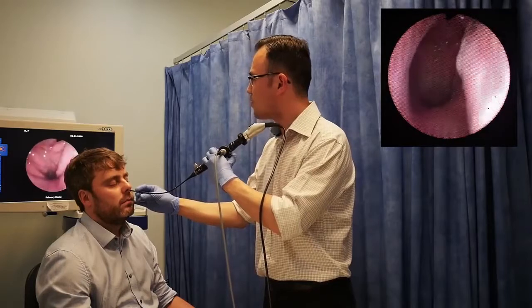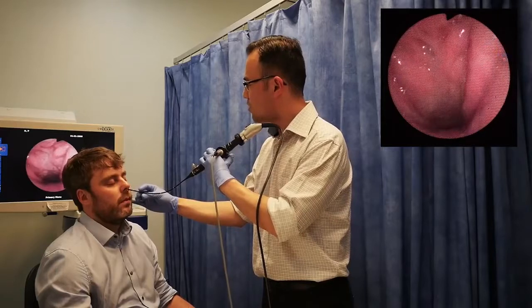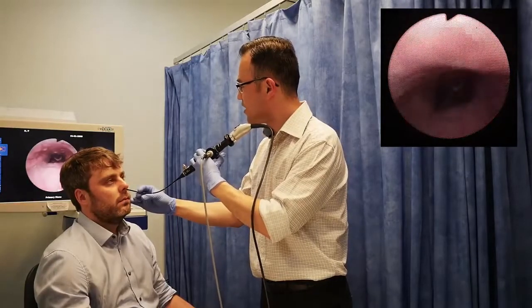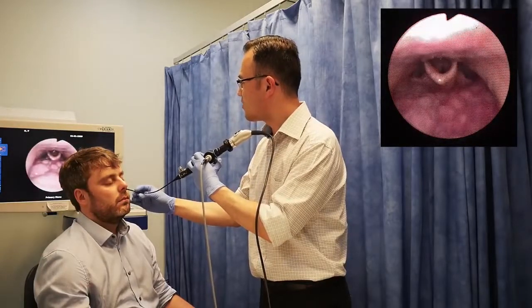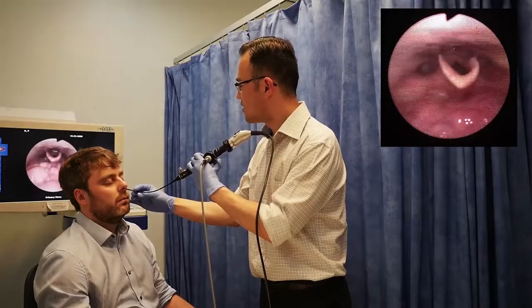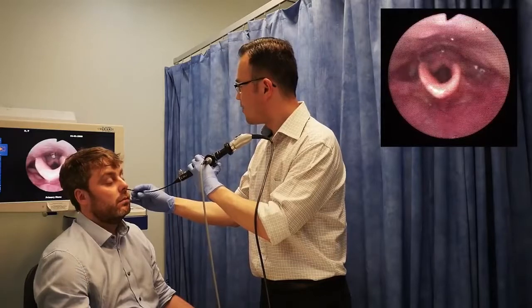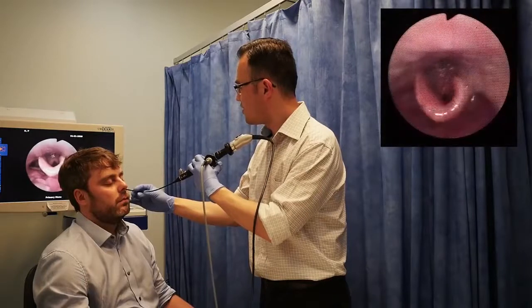Okay, and we've approached the nasopharynx. And sometimes the nasopharynx is closed, and I'll ask the patient just to breathe through their nose to open up the nasopharynx, and at this point I'm going to direct the scope downwards and continue advancing the scope, and you can start to see the tongue base there, and just over here that's the uvula, and in the distance the epiglottis. And I'm just going to carry on advancing the scope now, keeping the view right in the middle, and you can see the vocal cords in the distance there, right? So we've got a very normal view in this situation.